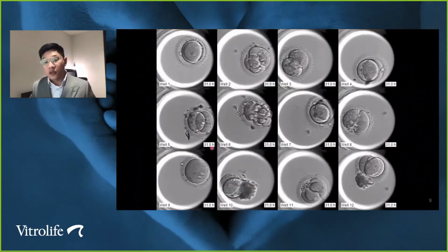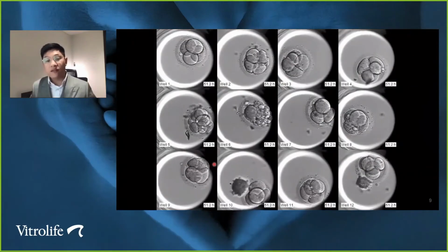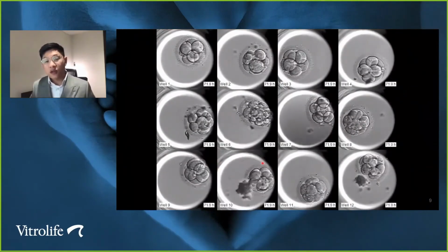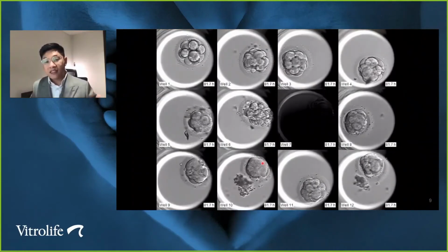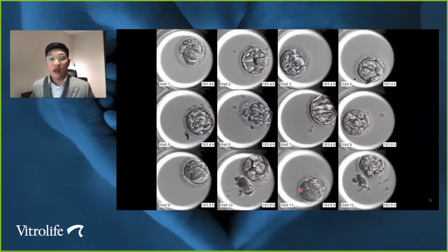Here's a time-lapse video of a human embryo growing inside a Vitrolife time-lapse incubator for 5 days. And the problem we're trying to solve is to look at this video and estimate the chance that each of these 12 embryos will result in a pregnancy.